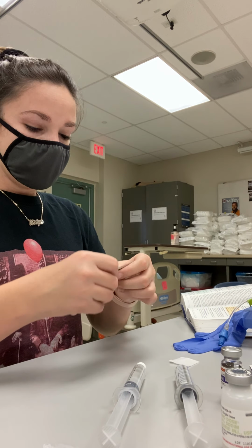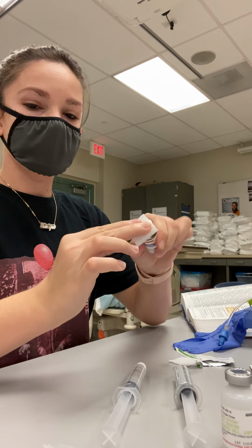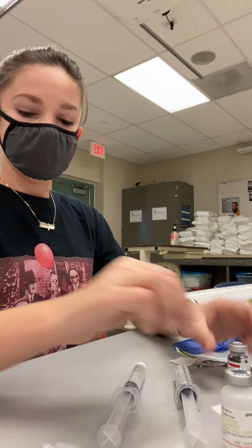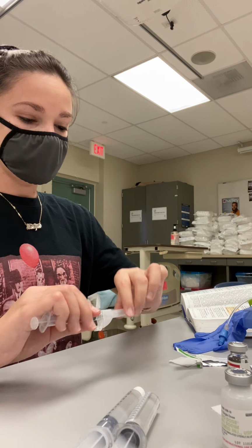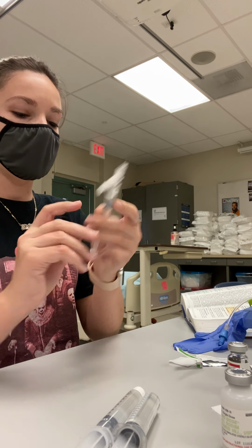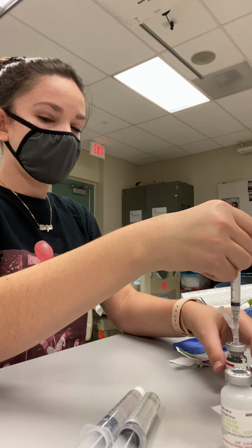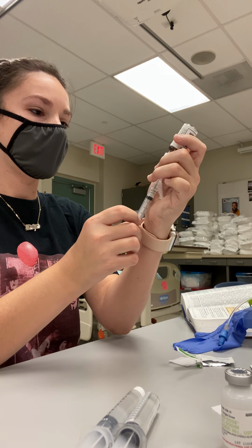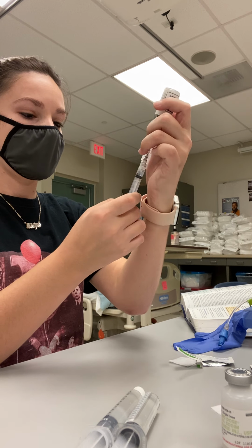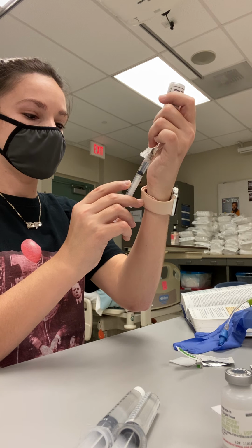So you will clean the vial. Okay. So let's do that. I'm going to put this on. You'll be putting 1 milliliter of air into the vial. Blood return, okay, before you pull. Attach this part. Okay, for 15 seconds again.